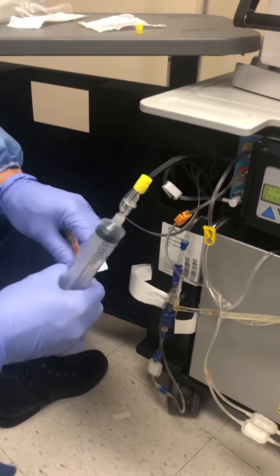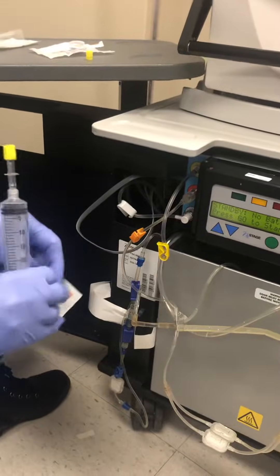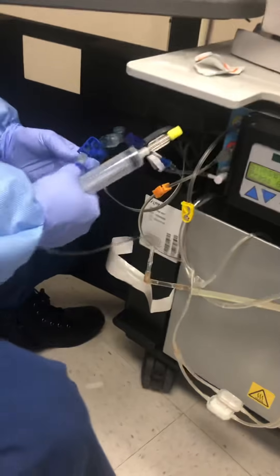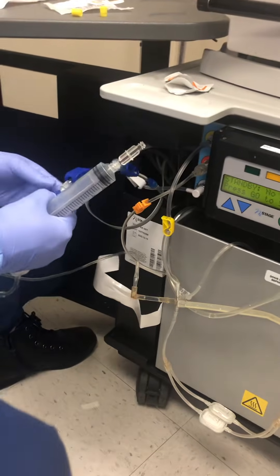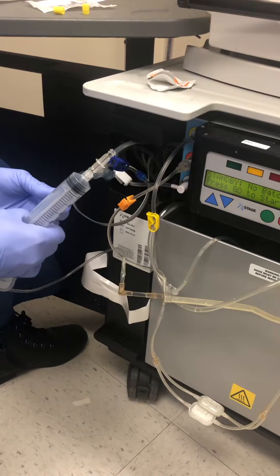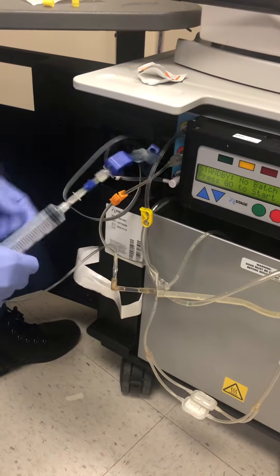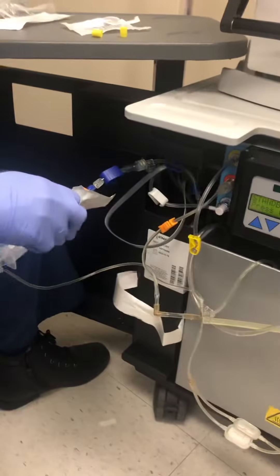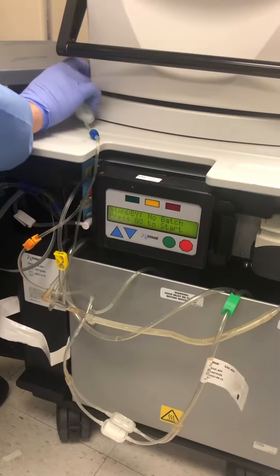Now this alcohol swab — I need this to put on the other end of the line to make sure it doesn't get contaminated. And make sure you do not contaminate the tips. You can insert it somewhere.